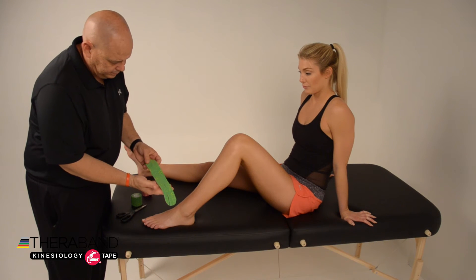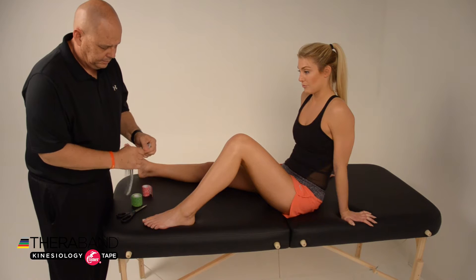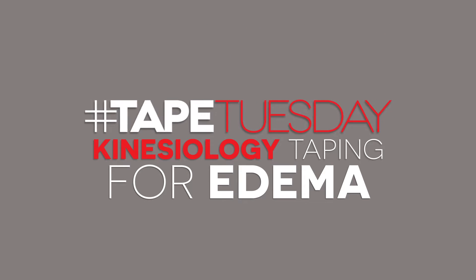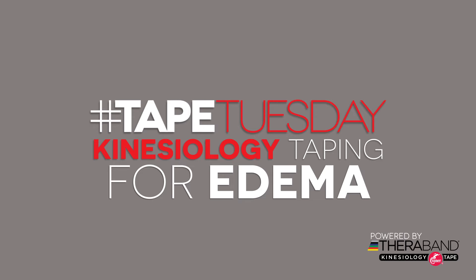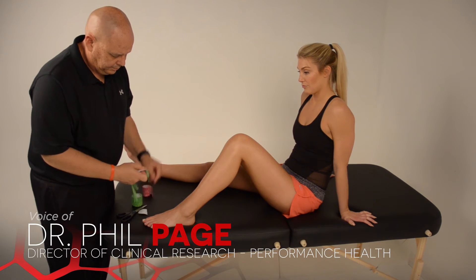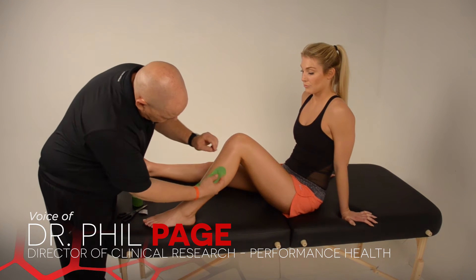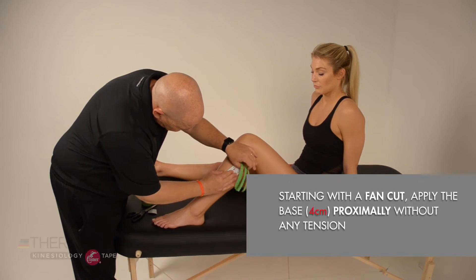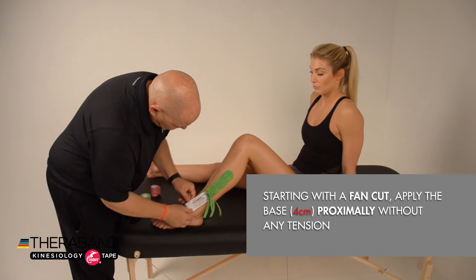For kinesiology taping for swelling, we're going to start with a fan cut. We'll break the backing about four centimeters or so for the base, and apply that base proximally without any tension.